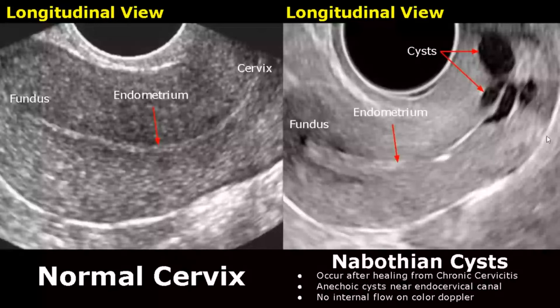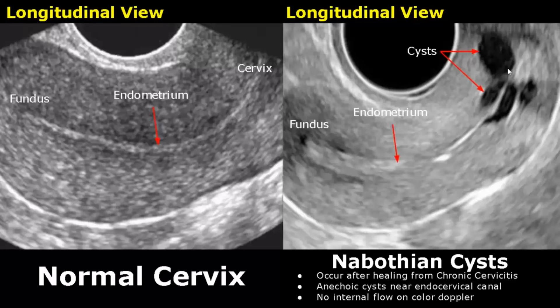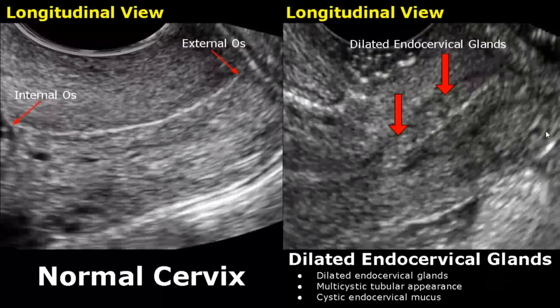Nabothian cysts are benign cysts that usually occur after the cervix heals from chronic cervicitis. We will see anechoic cysts near the endocervical canal; some cysts may have internal echoes. On color Doppler, we will not see any internal flow. Here we can see three cysts, and here is another image showing a single Nabothian cyst near the endocervical canal.